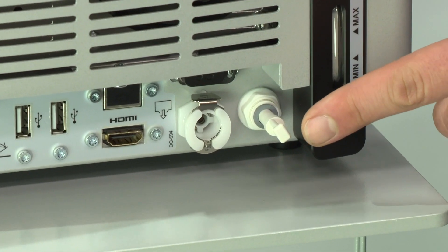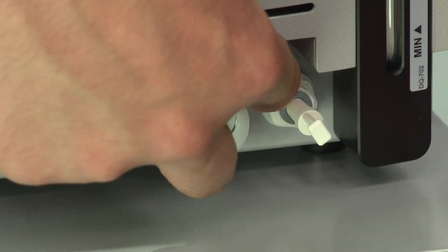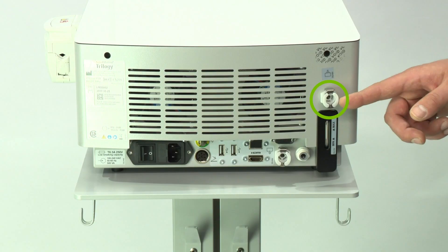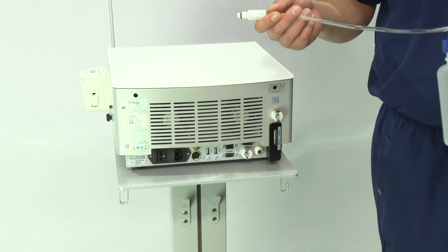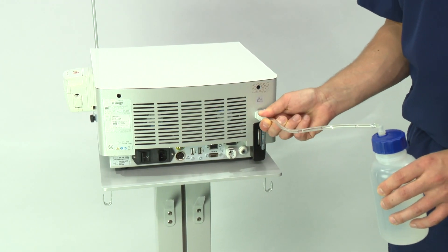On the back of the Trilogy console, remove the air vent plug by pushing the gray ring and simultaneously pulling the air vent. Locate the fill inlet connector and make sure that the metal locking part is in the down position. Push the filling tube into the fill inlet connector until it engages.